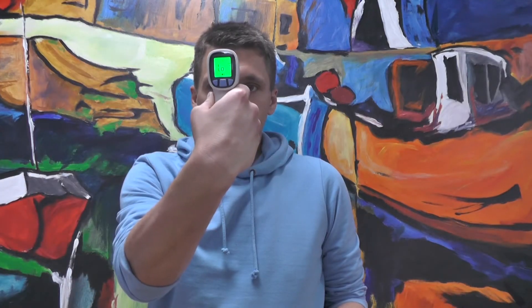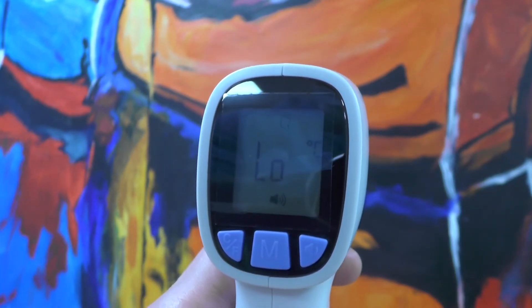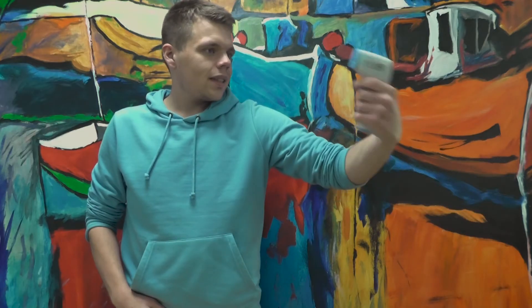The device is best used to assess temperature on your forehead, but it can also be used inside your mouth and ear. Press the M button in the middle to make sure the device is on person mode before measuring someone's forehead temperature.